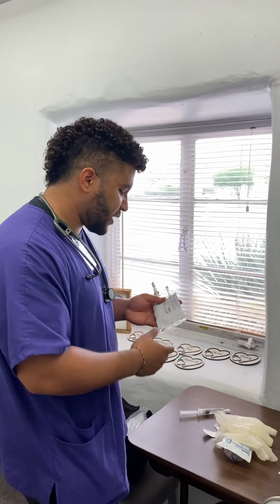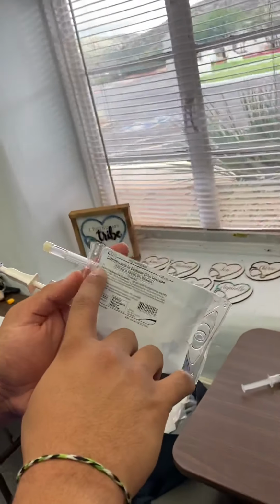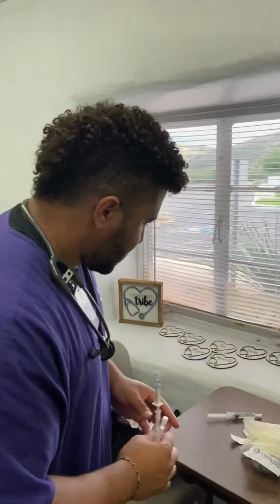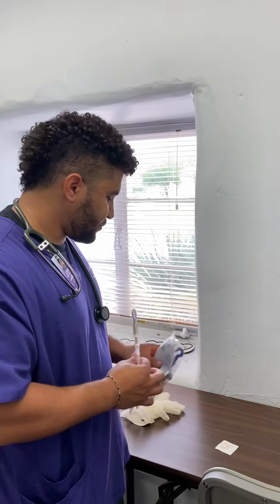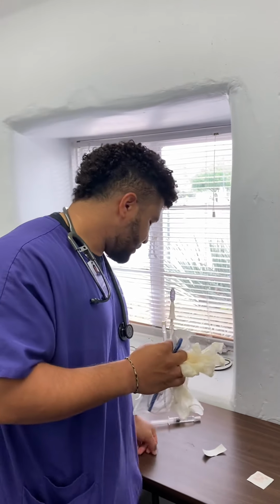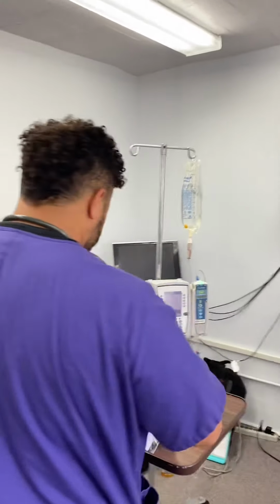So you go ahead and select your medication and you make sure that it's the right dose: 200 milligrams and 100 mLs, ciprofloxacin. So we have our medication. You go ahead and grab your secondary tubing, your two gloves, and your label for the secondary line. And you can come over here into the patient's room.